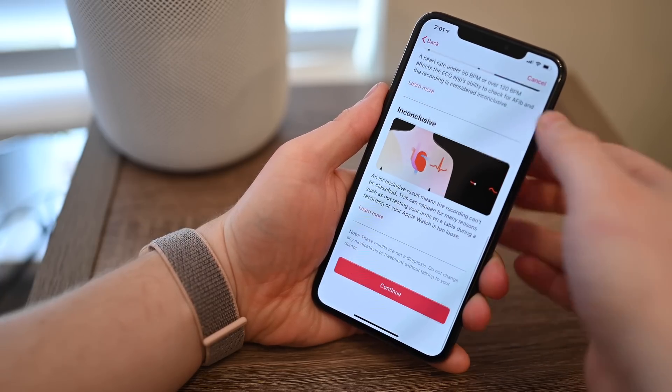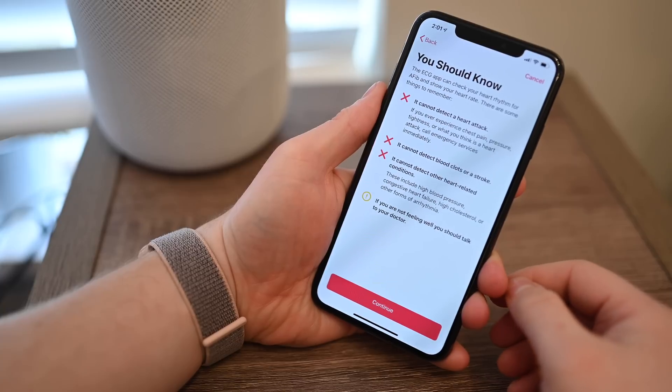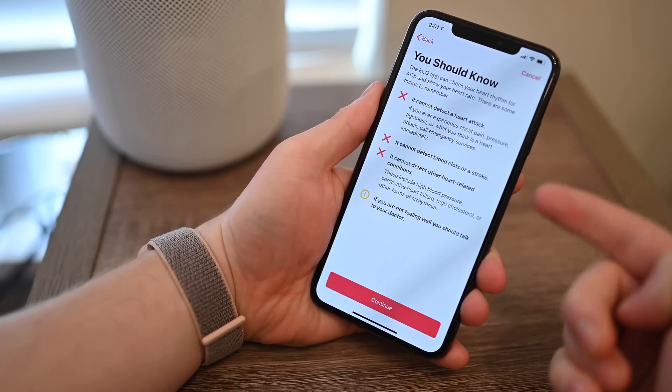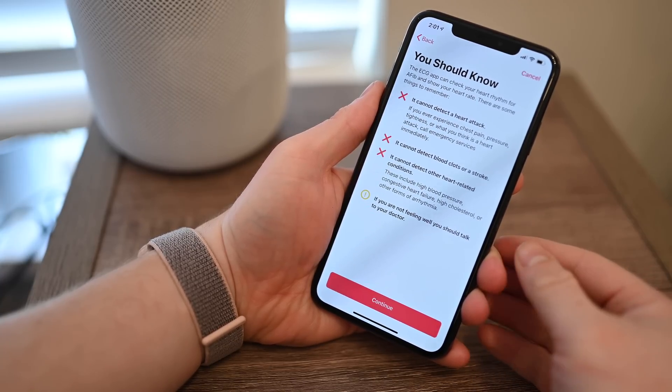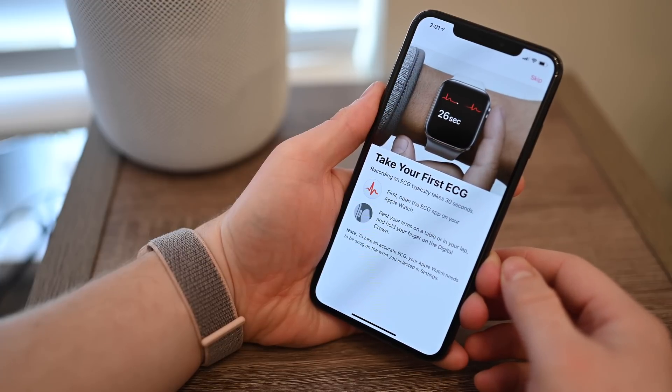Just as important as understanding the results you might see are the results you know you won't see. The Apple Watch and the ECG app are not able to detect a heart attack, a stroke, or other heart issues. So if you feel like something else is wrong, be sure to talk to your doctor.